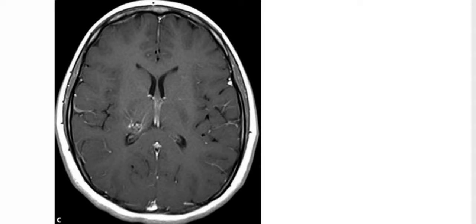So considering this key finding of a circumscribed lesion with central increased and peripheral decreased signal giving a characteristic popcorn appearance, this is the typical imaging picture of cavernous malformation, that is cavernoma. So this should be the only differential here, that this is a case of cavernoma, that is cavernous malformation.